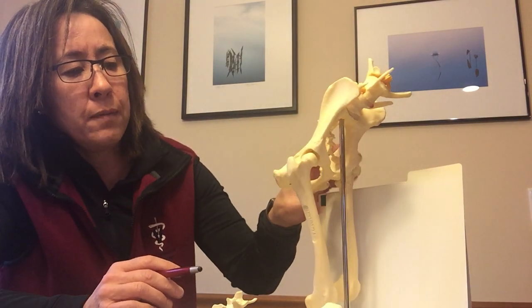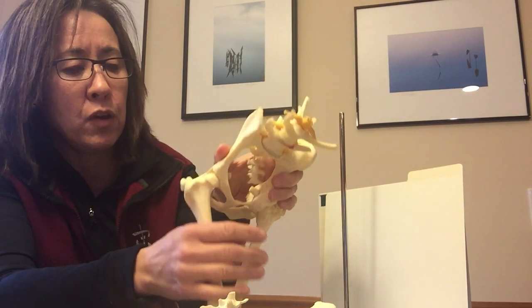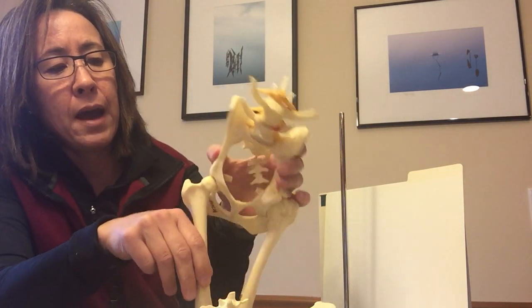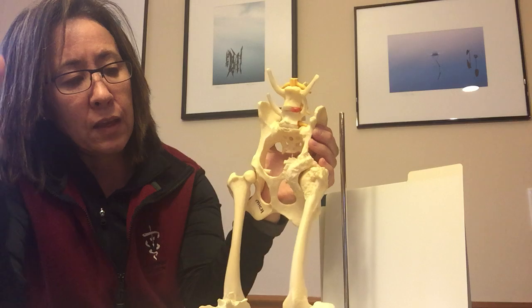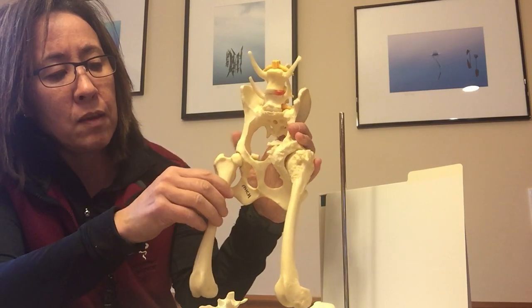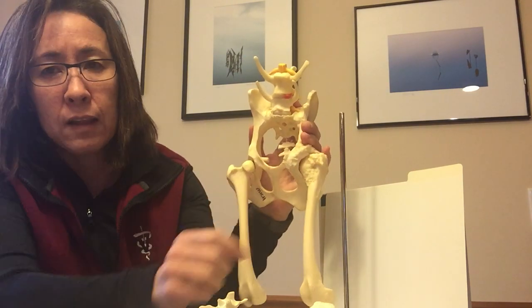With PennHIP there are three sets of x-rays. The first x-ray taken is the standard one, which most people know as the OFA radiograph — basically what's called a hip extended view. The dog would be on its back with the femurs extended down, and the x-ray is taken. What you're seeing on this extended view is the amount of potential subluxation, how much the hip is sitting into the joint, and whether there are any overt signs of arthritis present.